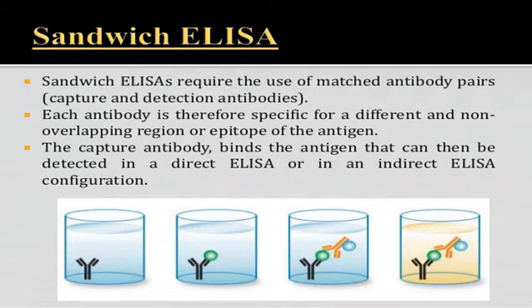These are enzyme-linked antibodies. And then we put the substrate. Now, if the monoclonal antibodies coupled with an enzyme is binding to that particular antigen, then the color will develop. So when the color develops, this confirms that the antigen is present in the patient sample.